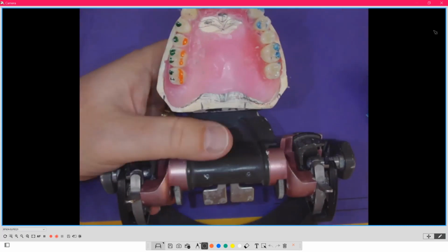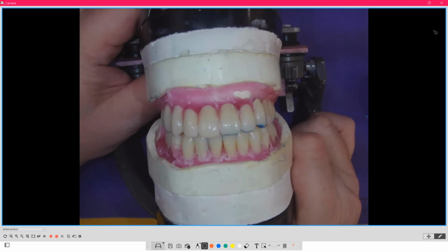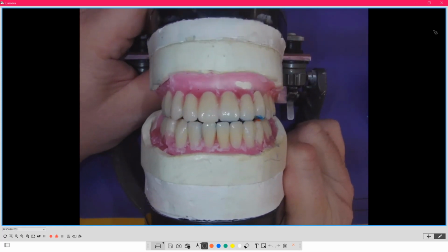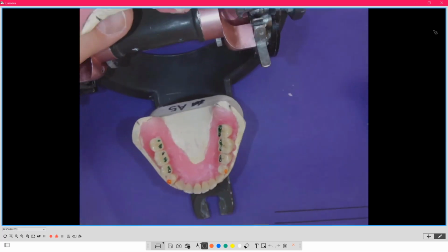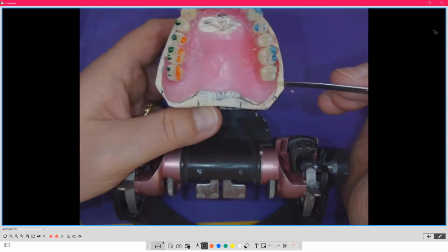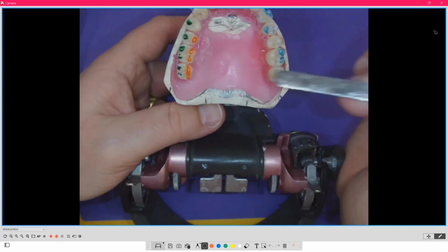Then we have the ability of the freedom in Centric, so the teeth aren't locked together, and they function and have a landing pad. And then we start to adjust and modify the tooth to a person's specific chew cycles by identifying the teeth like I've marked for you. So green are buccal upper, lingual lower. Those are the freedom cusps. Red was the cutter, so the pulverizer that fits into the fossa.